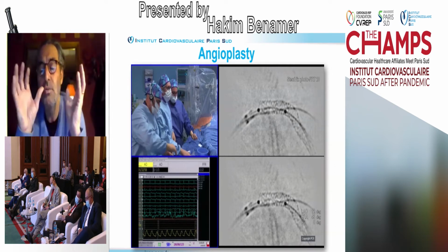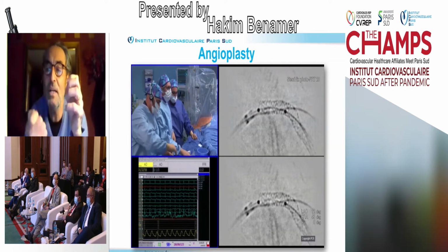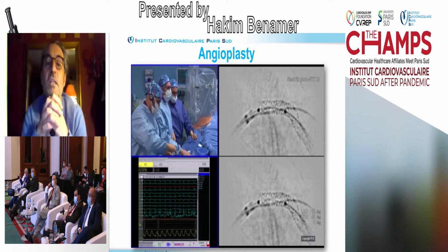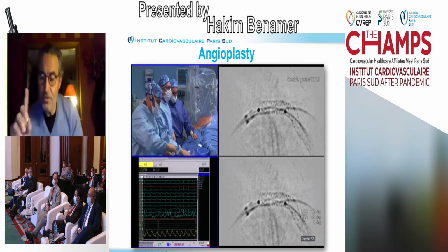So if you can leave the ostium of the left main without any stent to be compressed, it is better for us. But in this case, as Dr. Magid mentioned, there is a short left main, so the distance for both will be insufficient. It is a very good point.